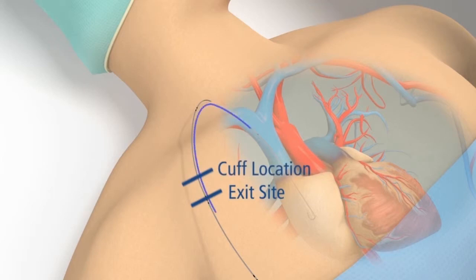With a measuring tape, measure from the cuff site back to the venotomy site, and then down the mid-clavicular line to the third intercostal space approximating the mid-right atrium. This measurement will give you an estimate of the tip to cuff measurement or insertion length of the catheter.